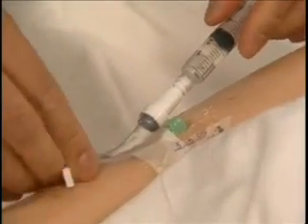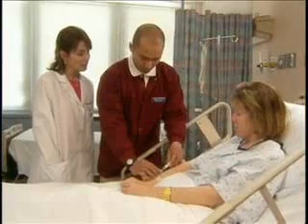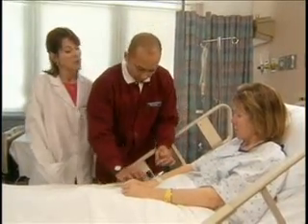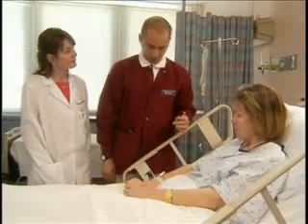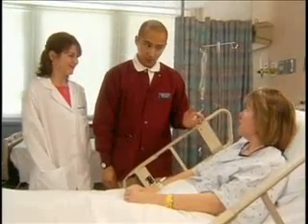Unclamp the short extension tubing, and now flush the line. Now remove the syringe carefully and reclamp the tubing. You can use tape to secure the extension tubing if needed. I think it's all secure. All set. Thank you. Buzz if you need anything.